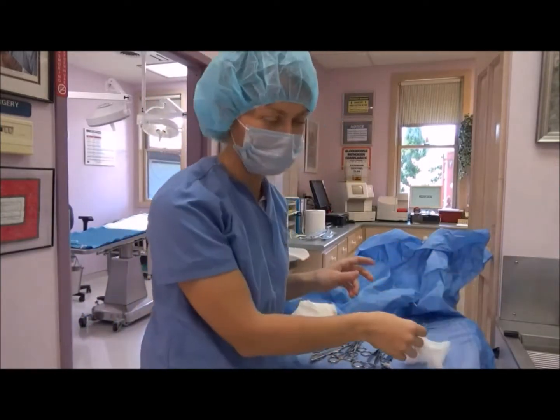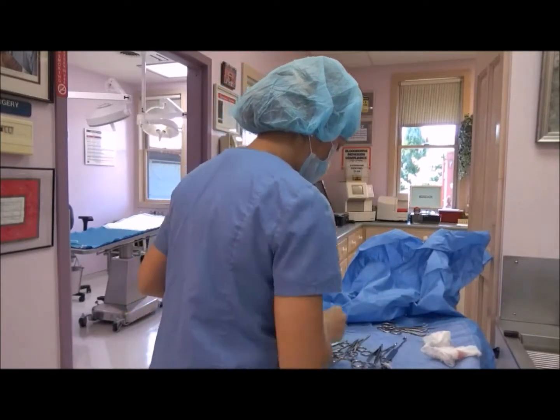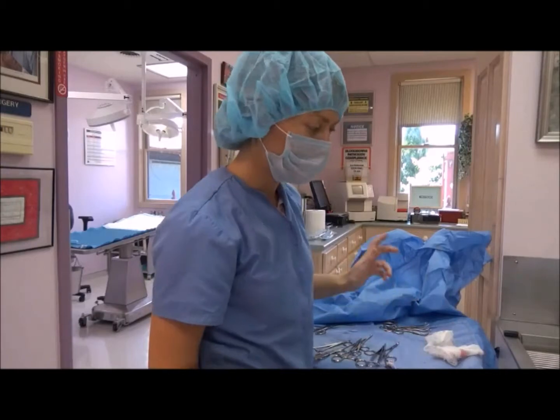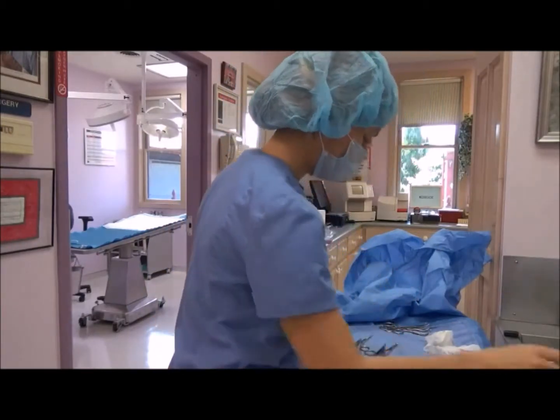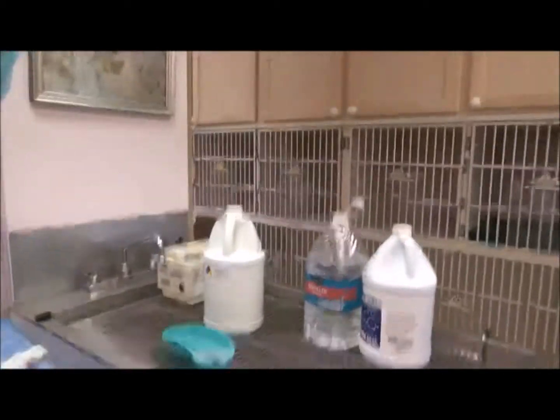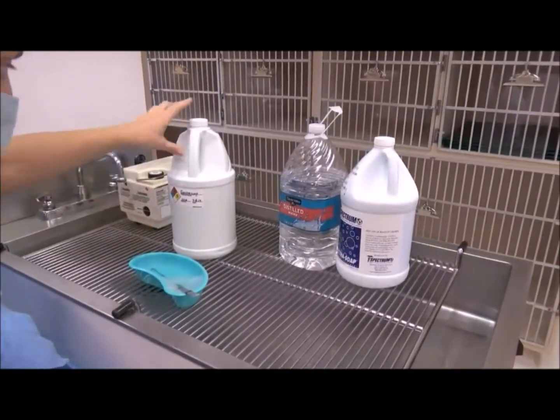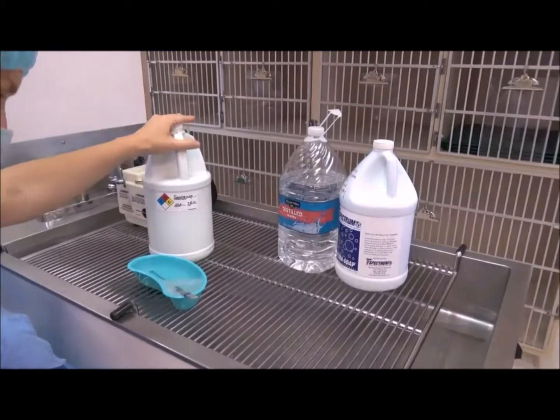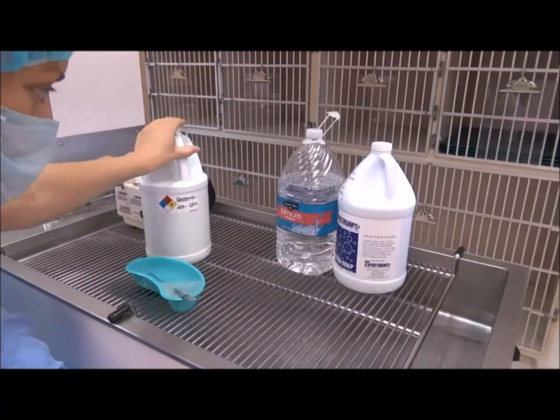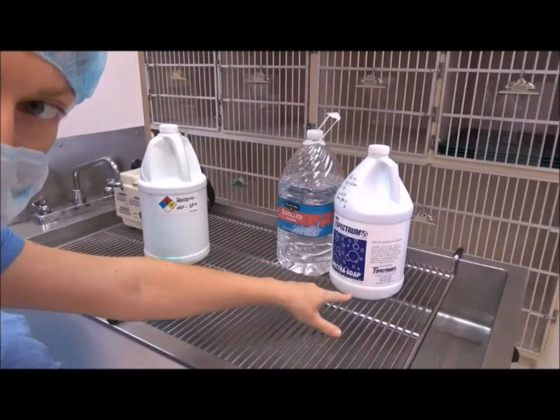I'm obviously going to dispose of all of the used sponges here. Our tools, we started with 18 tools, so I'll count them as I'm placing them into our dish here. I'll show you this because what we have here is Spectra soap. So this is like our pre-mixed jug. It's a mixture of distilled water with this Spectra soap high suds detergent.